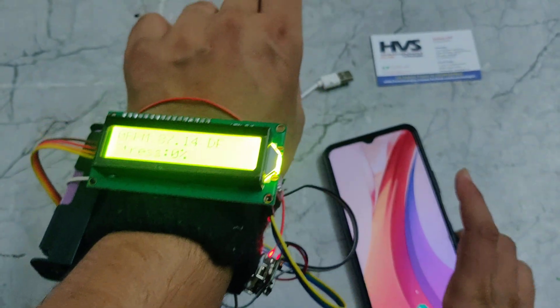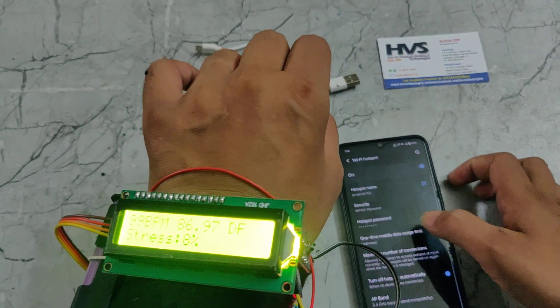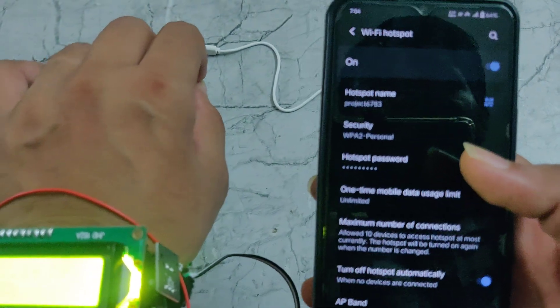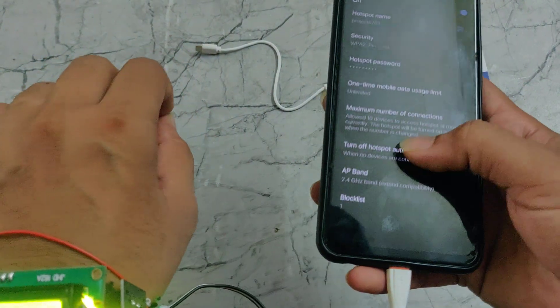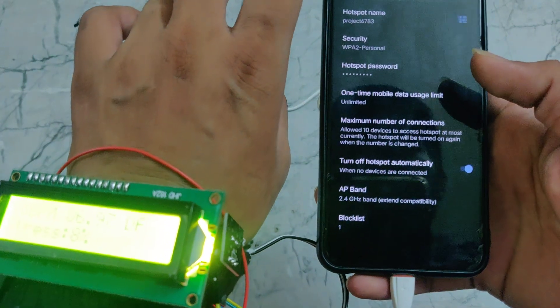First of all, we need to set our hotspot settings. We need to set our hotspot name as PROIT6783 and the password should be 129. Also, the AP band should be set to 2.4 GHz — only then will this ESP32 module connect to our phone.